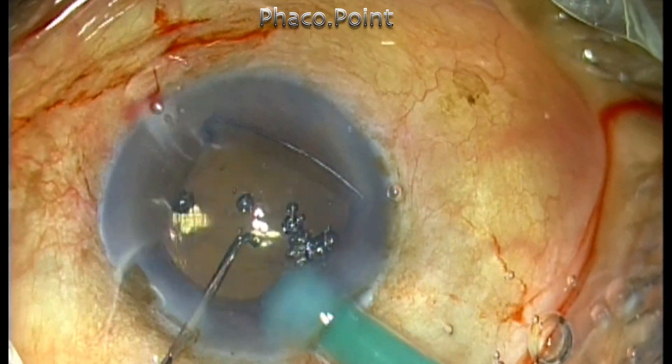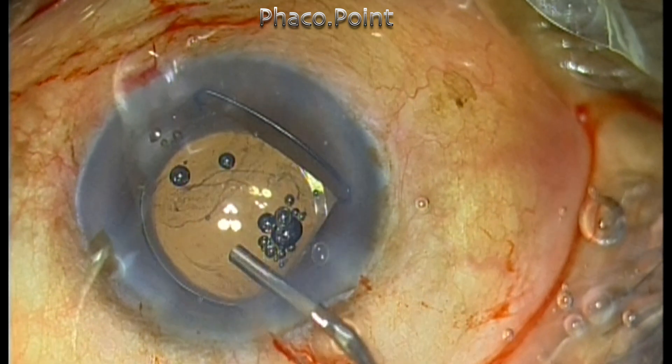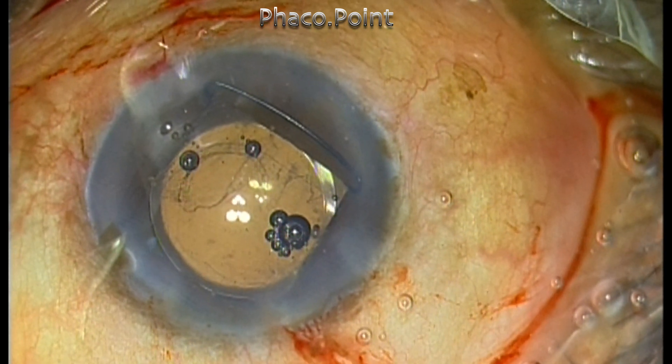This time the IOL is successfully implanted within the capsular bag. The case is concluded by finally removing the Gupta ring from the eye.